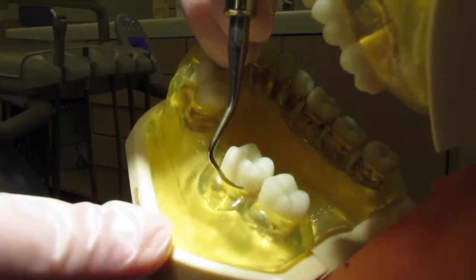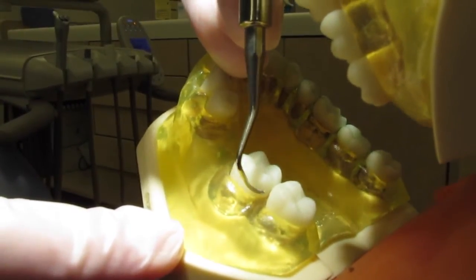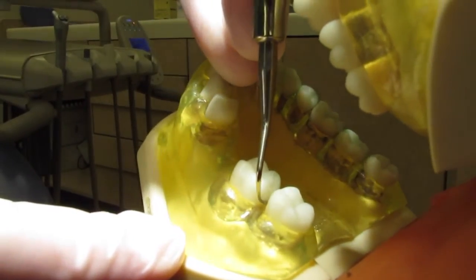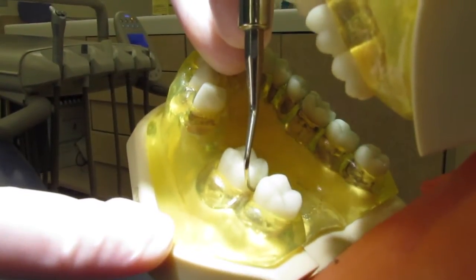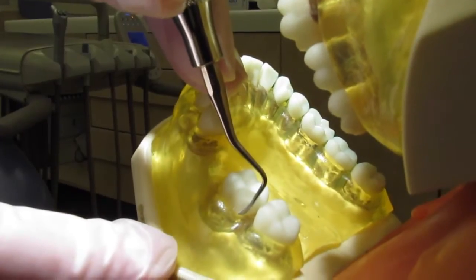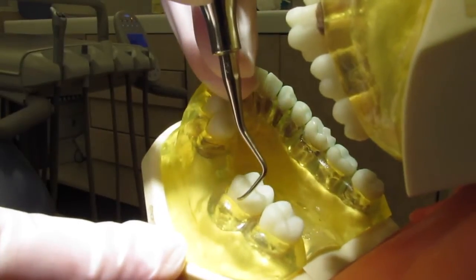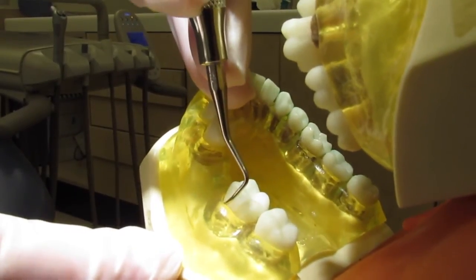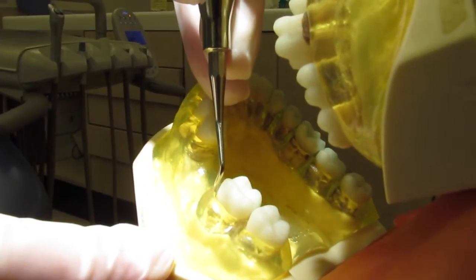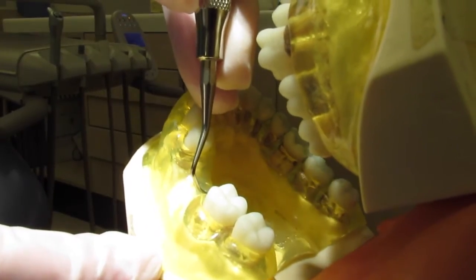We're at the distal line angle again, and we're going to go ahead and go distally — short strokes, keeping that leading third adapted. Then we'll come back out and start at that distal line angle again, and then just rock. Approaching that mesial line angle, we'll start rolling and pivoting, making sure to keep that terminal shank upright.